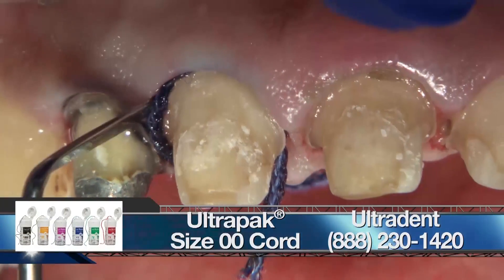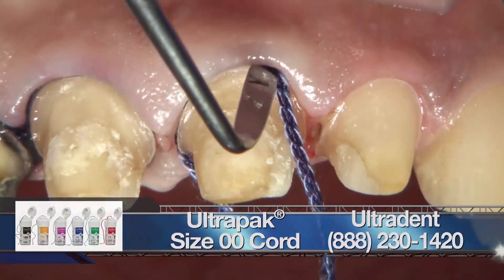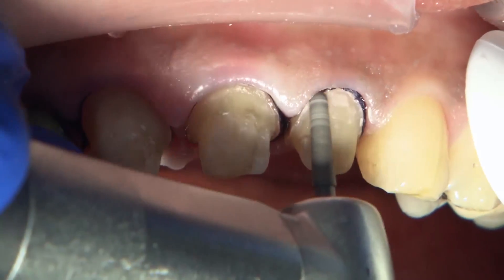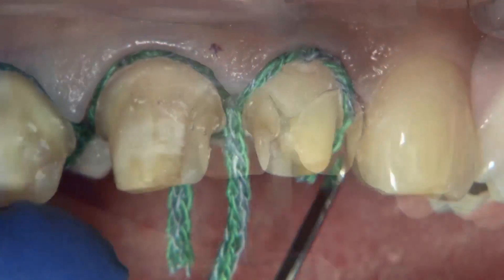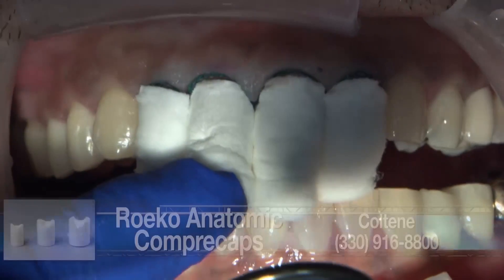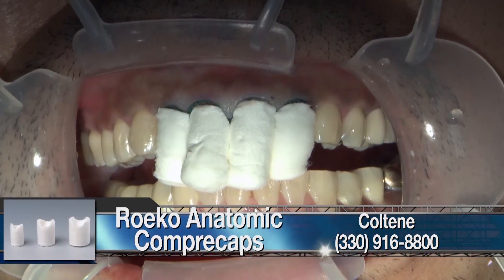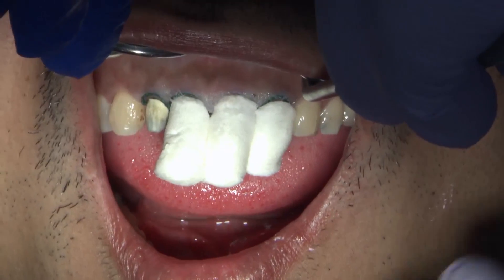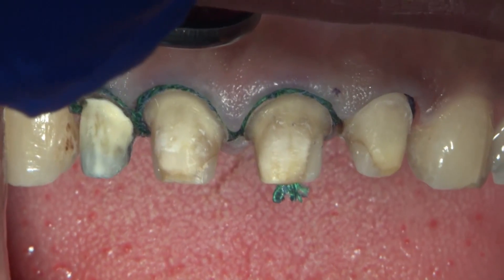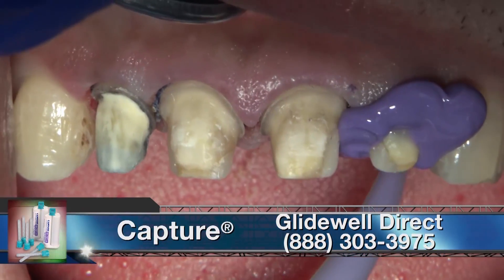The two-cord technique is utilized so that we can capture the margins. Once the first cord is placed, we'll go ahead and refine our margins and make sure that we have nice, clean, visible margins. Then the second cord is placed along with some cotton rolls or Compre Caps. I really like using these Compre Caps because the pressure on the tissue helps the retraction and also helps with hemostasis around those teeth. After a period of three to four minutes, we can go ahead and remove that second cord and inject the light body and medium body impression materials.